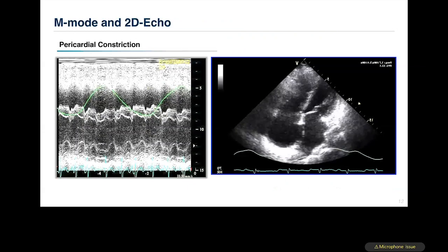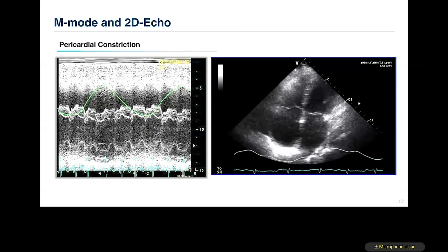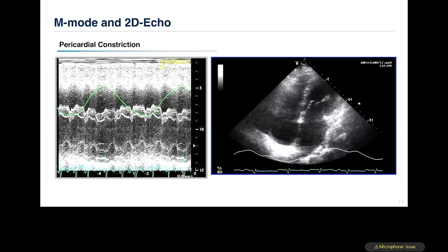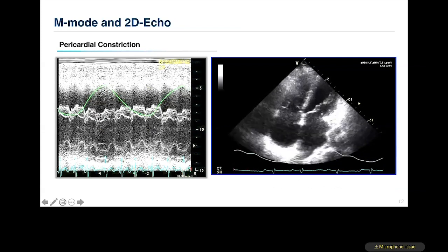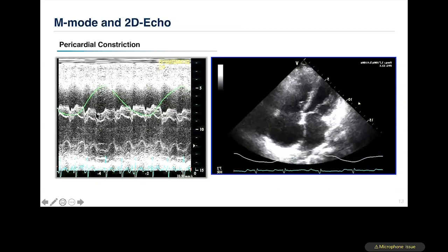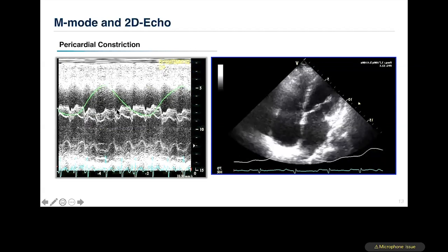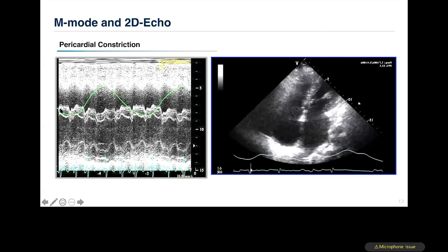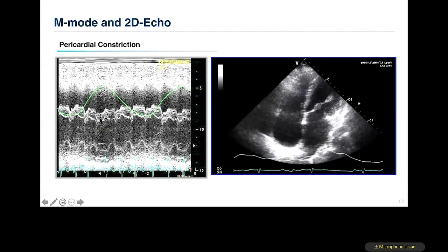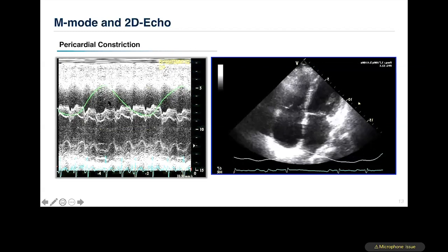One of the most important changes first described using M-mode and 2D echo was the abnormality of septal motion. There are two types: the first is septal shudder — a sharp, high-frequency bouncing motion of the septum during each cardiac cycle. The second is the septum moving from the RV side to the LV side and vice versa — a back-and-forth respiratory shift.